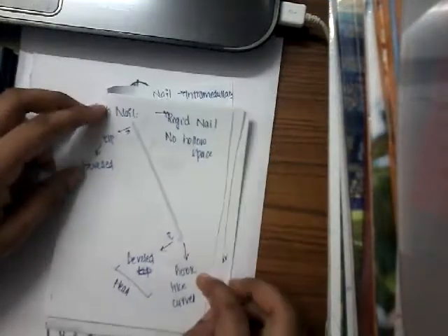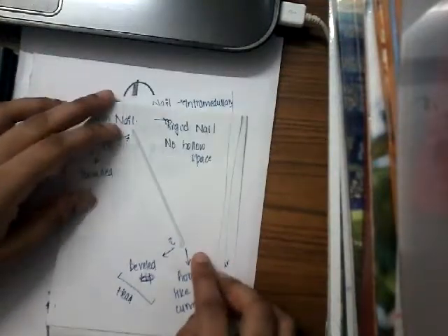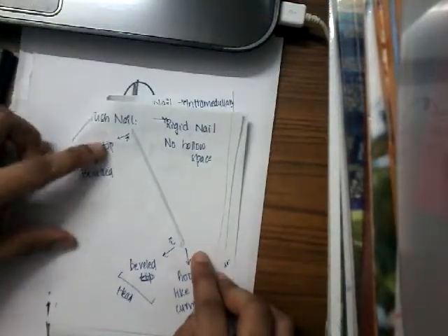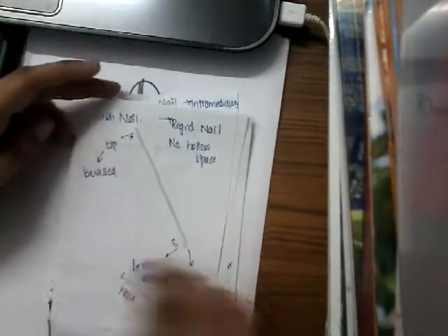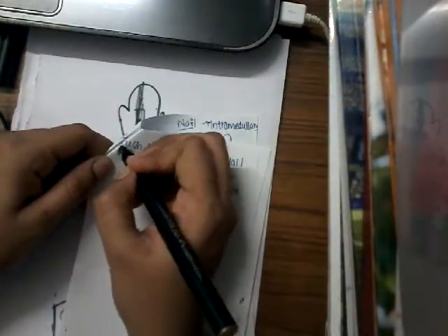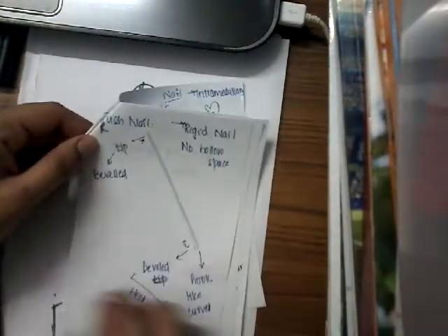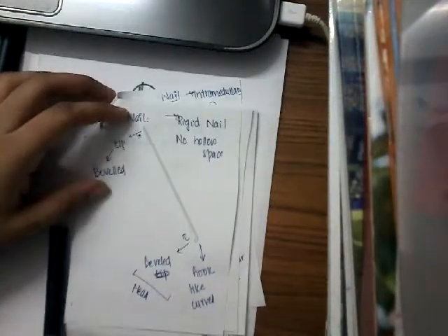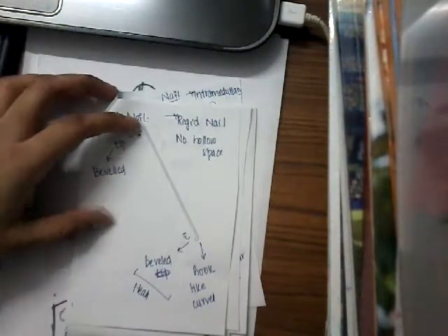If you see one of the tips of this Rush nail, it is beveled. It is Rush nail, R-U-S-H. One of the edges of this Rush nail is beveled.